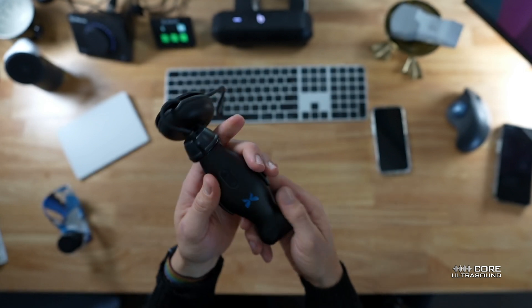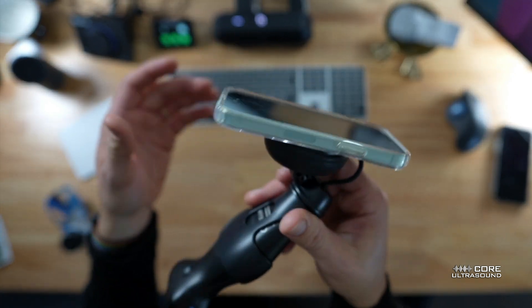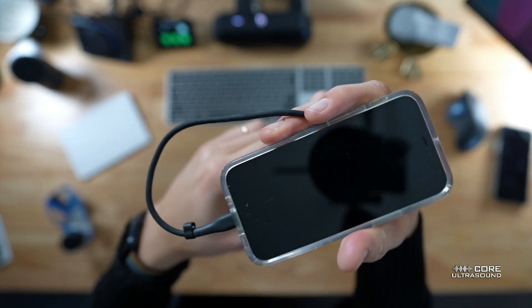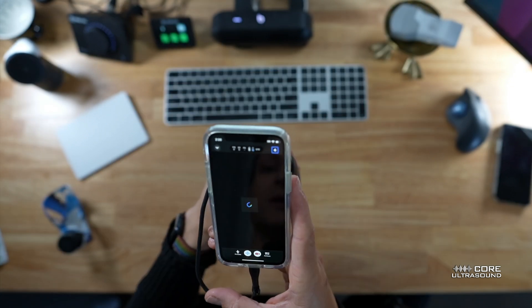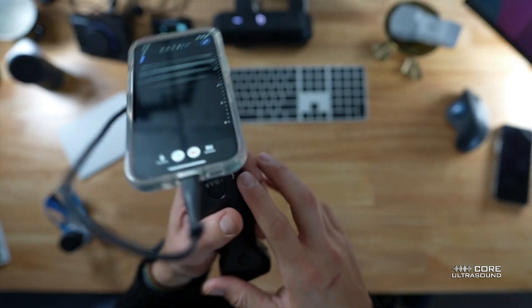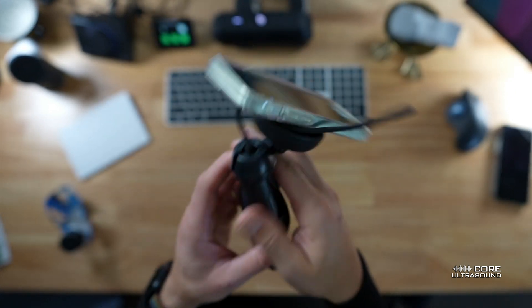So here you have your probe, and now you just slap your phone on it like that. Then you attach your cable here, and you are good to go. We can see now that it is nicely connected. I'm wiggling it around, and you can see that the mini, at least, is staying on there pretty nicely.